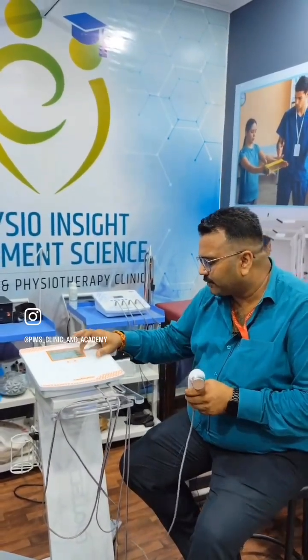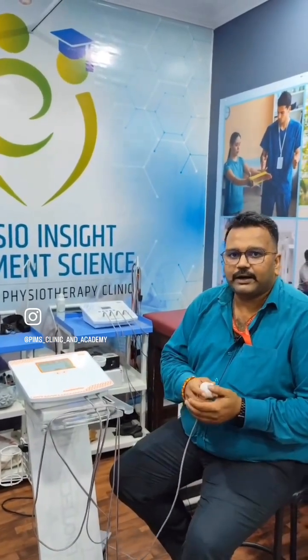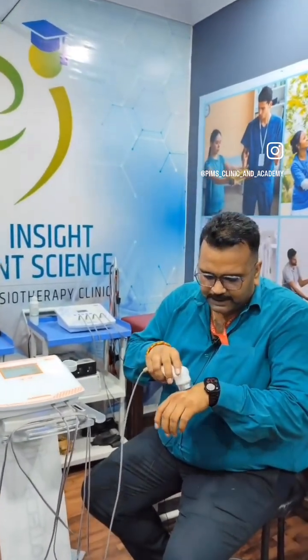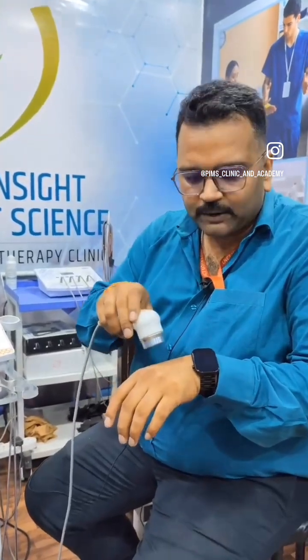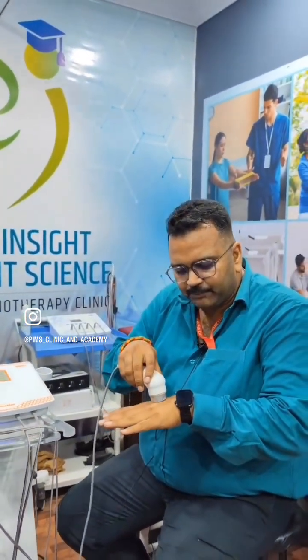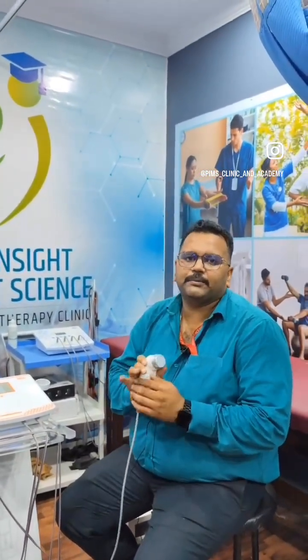One more thing you should consider about your treatment is how much pressure you should apply while giving ultrasound. I suggest when you want to give ultrasound therapy, you should apply just a pressure which is sufficient enough to move your skin along with the head. It should not be too light and it should not be too much pressure. So the pressure should be gentle and the underneath skin should move along with the head. That is the optimal pressure we should use while performing ultrasound therapy.